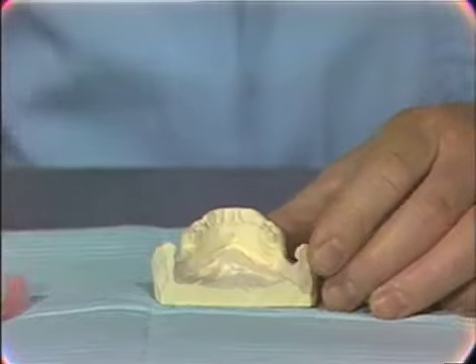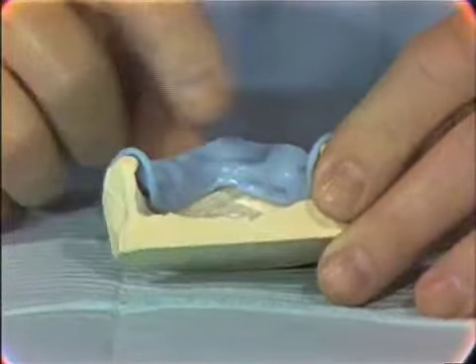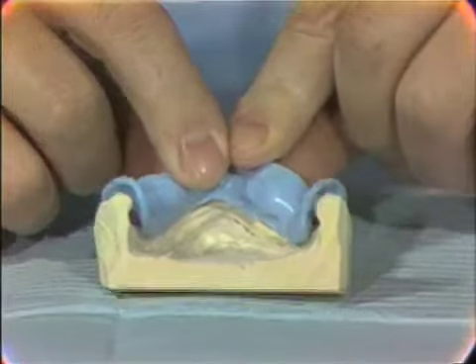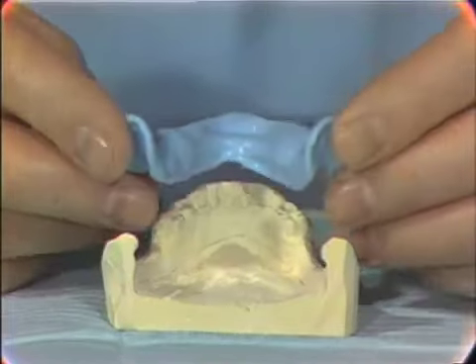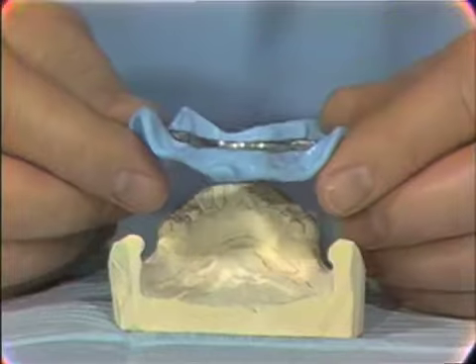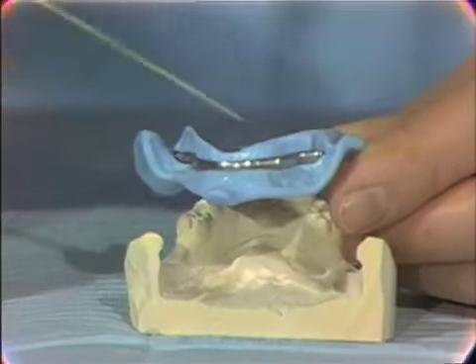If you can't use a cast aluminum tray, some of the acrylic materials can be used. This is a vacuum-formed impression tray made of the acrylic materials. The problem here again is gaining rigidity across the lingual bar area. As you see here, we have embedded a heavy wire in the lingual area of this tray.